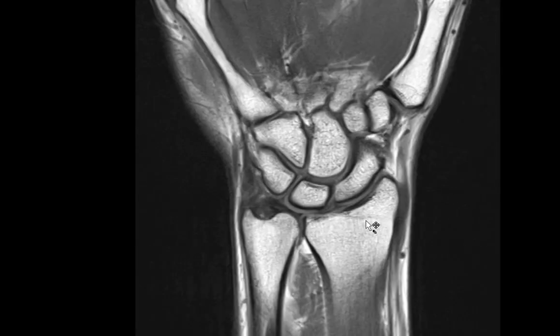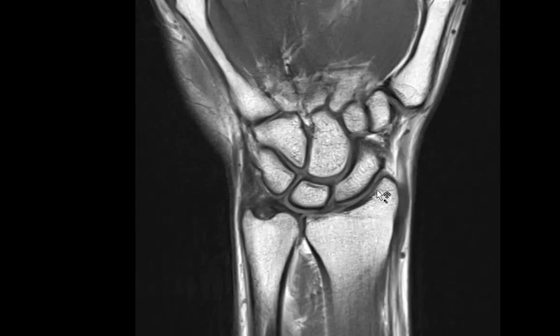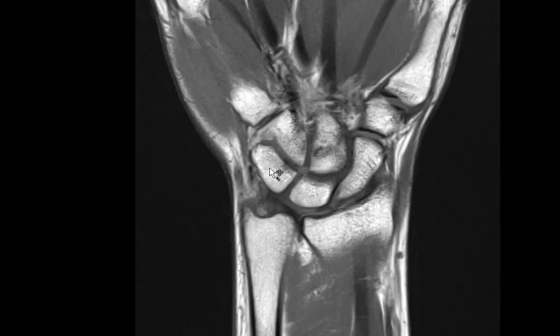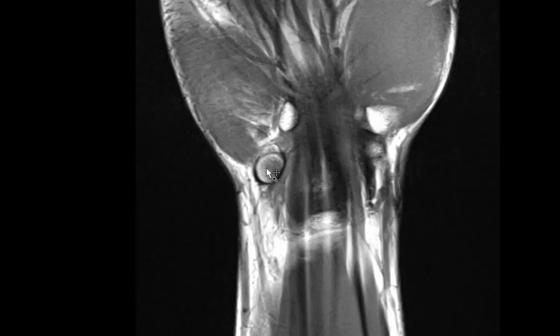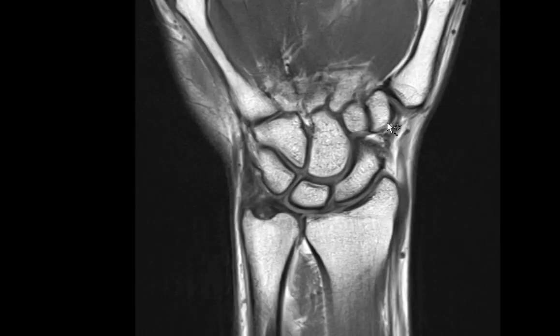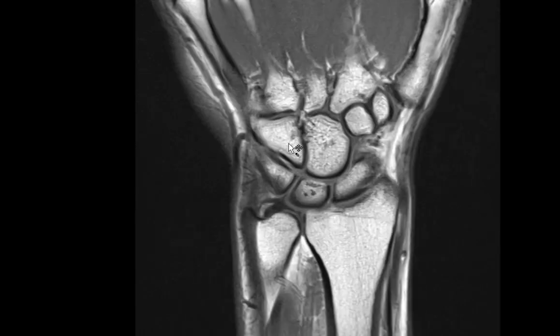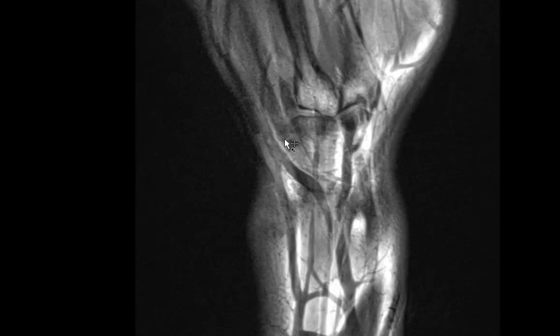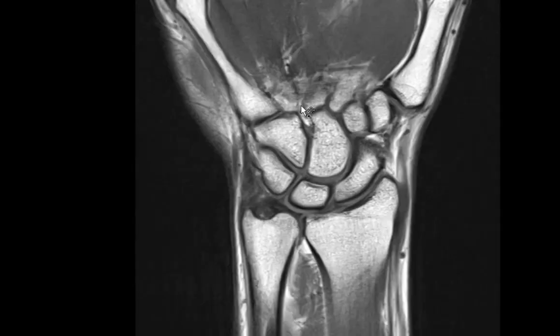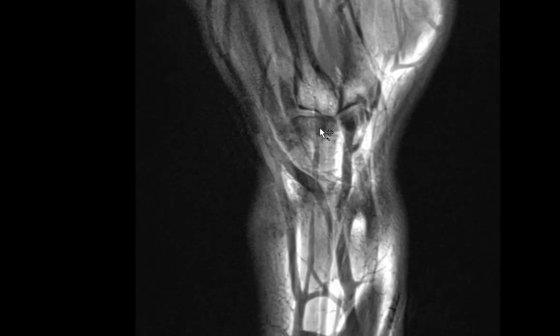I look at the radius, ulna, scaphoid, lunate, triquetrum, pisiform bone, trapezium, trapezoid, capitate, and hamate, and then I look at the base of all five metacarpals to make sure that there's no marrow contusion or fracture.